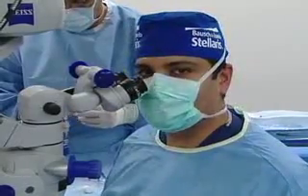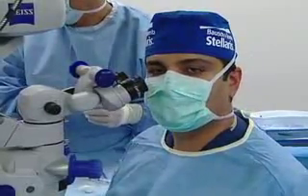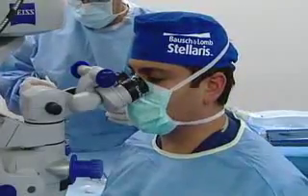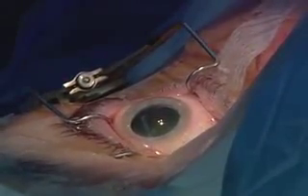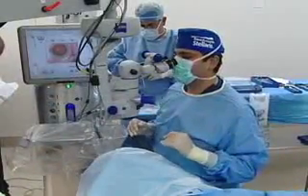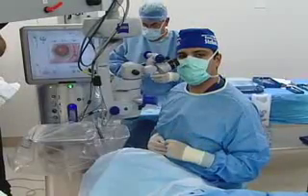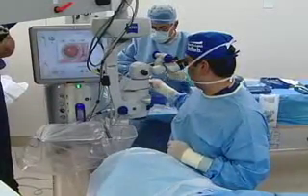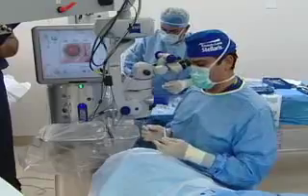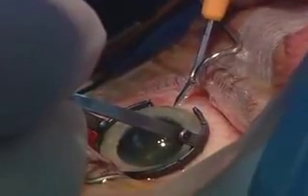We're going to do our next case here. Our next case is a Crystalens patient. I did his first eye about a month ago — it achieved 20/15 minus two at distance and a fabulous J2 for near. Vision was checked by my in-house optometrist. He wants a little bit more on the reading, so we'll do the second eye with a refractive target of maybe minus a half, maybe minus 75.